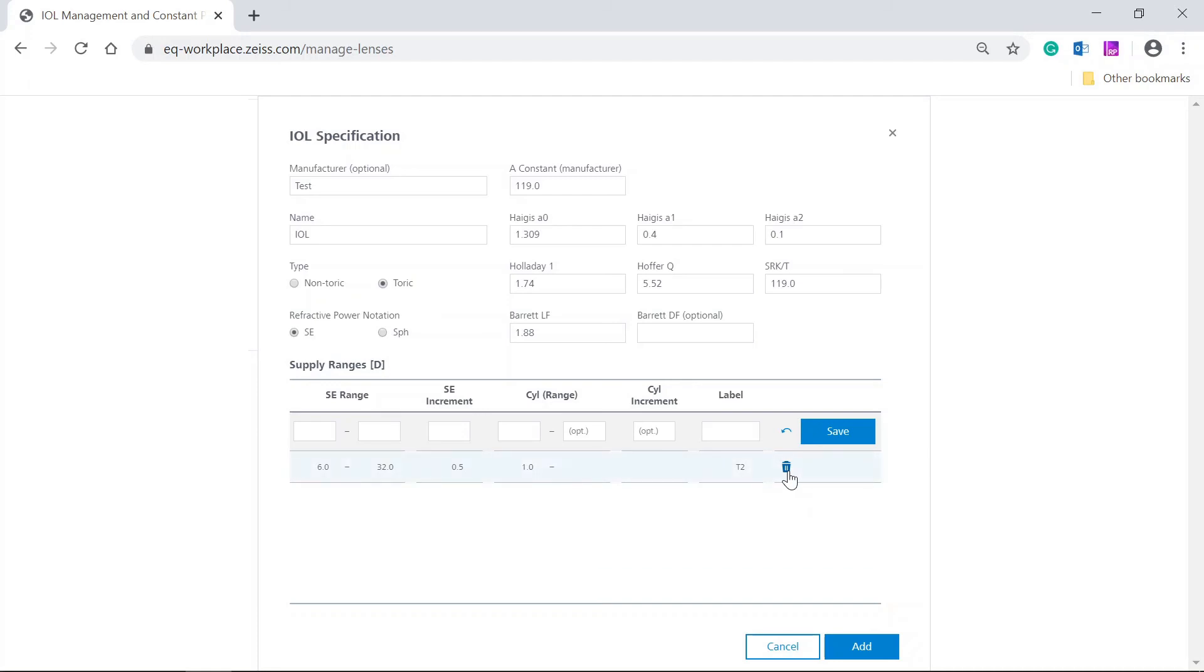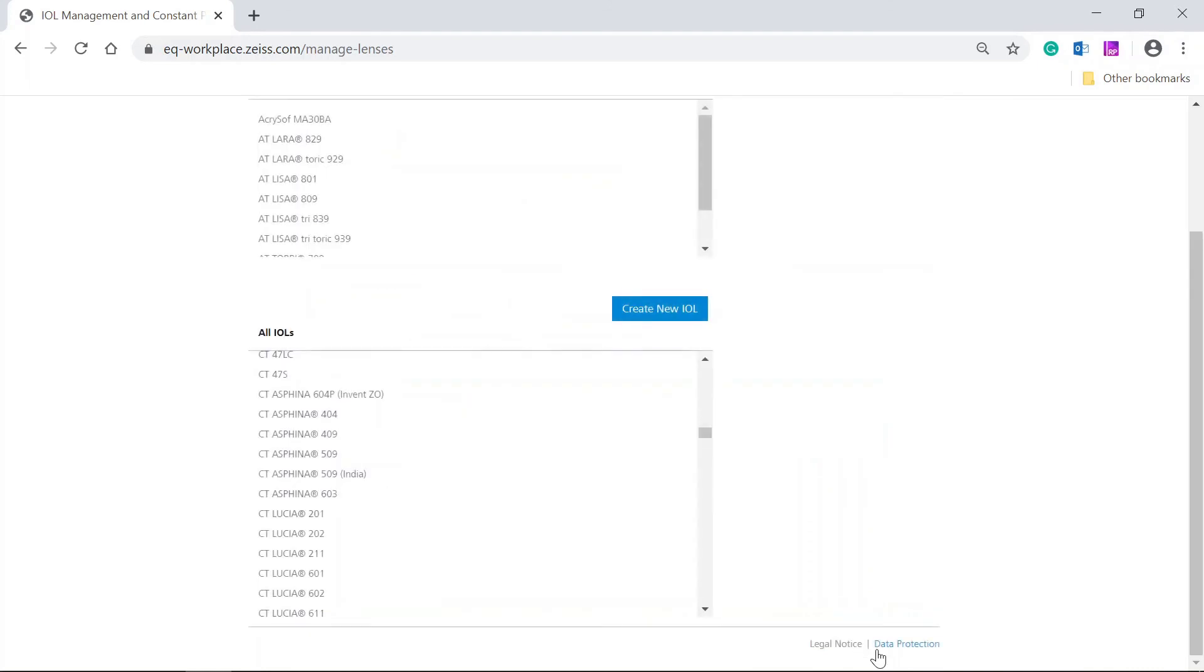After having entered all necessary parameters, please click on add. The new IOL is created and appears now in your personal list.